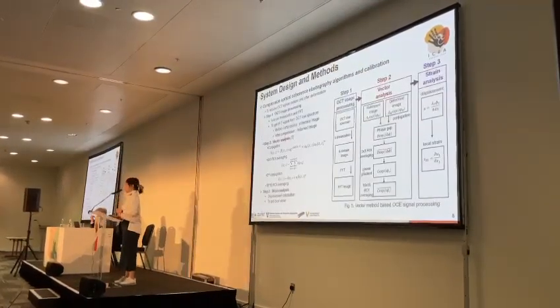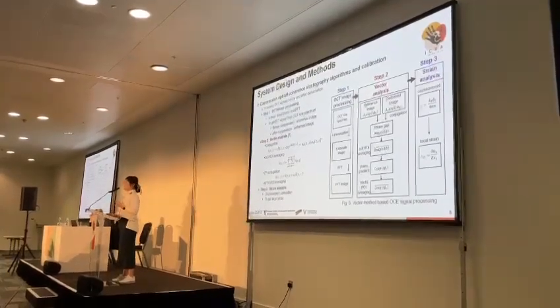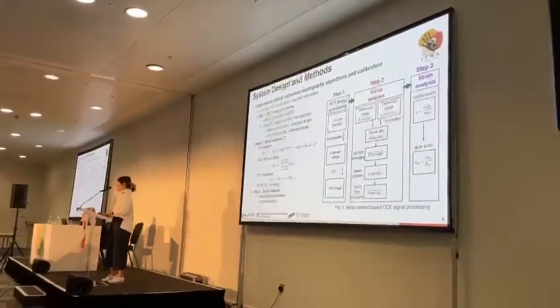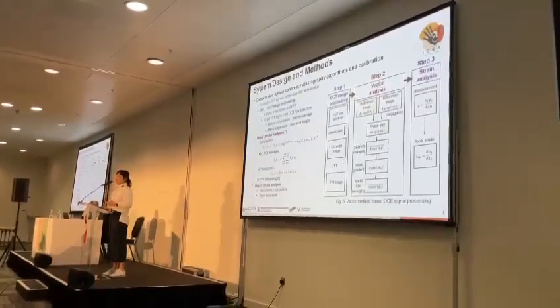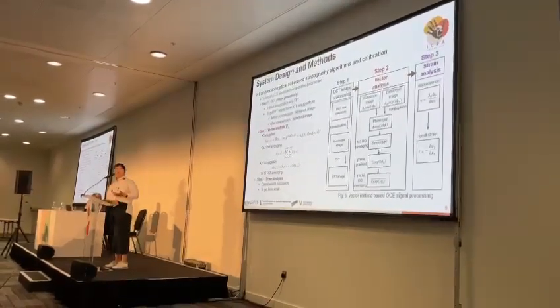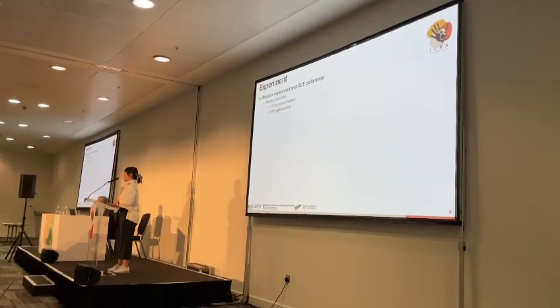The vector method uses the real and imaginary terms of OCT signals. Pixel intensity and phase are considered as the length and angle of a vector on the complex plane respectively. And the phase change can be calculated as an angle change of vector summation. The vector analysis method is shown in figure 5. Silicone and other phantoms are used for the experiment.